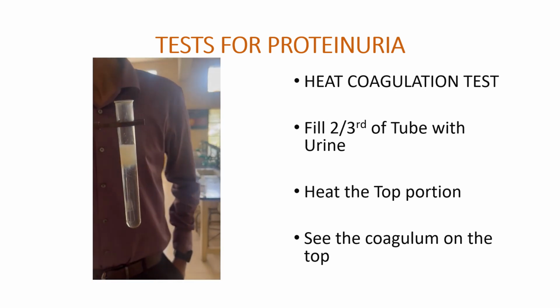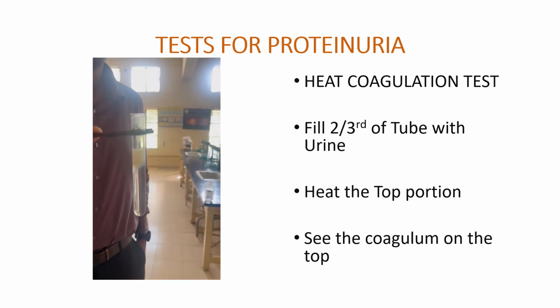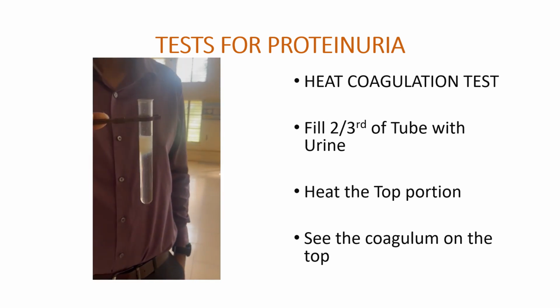Hopefully it's coming soon. Yeah, it did. So there we go, perfect. We have this coagulum which is formed at the top, and it's clear at the bottom.